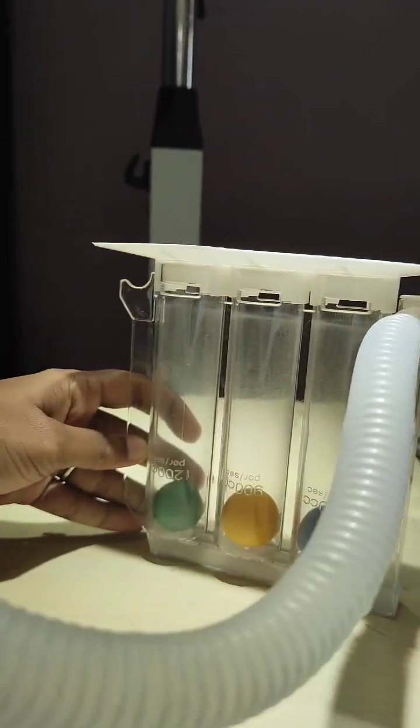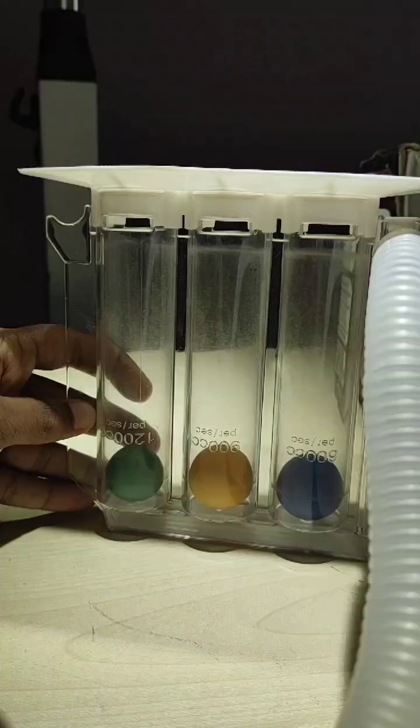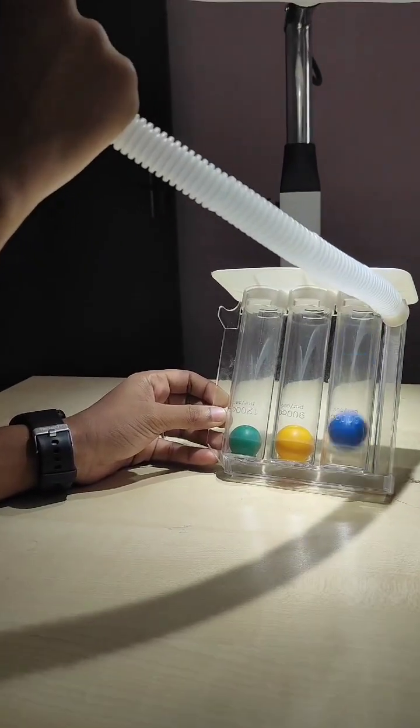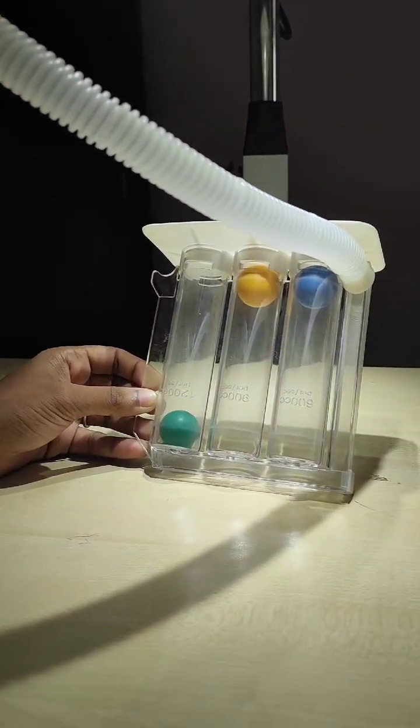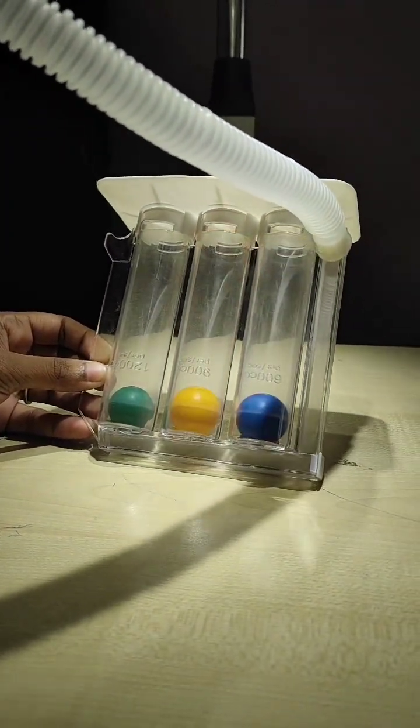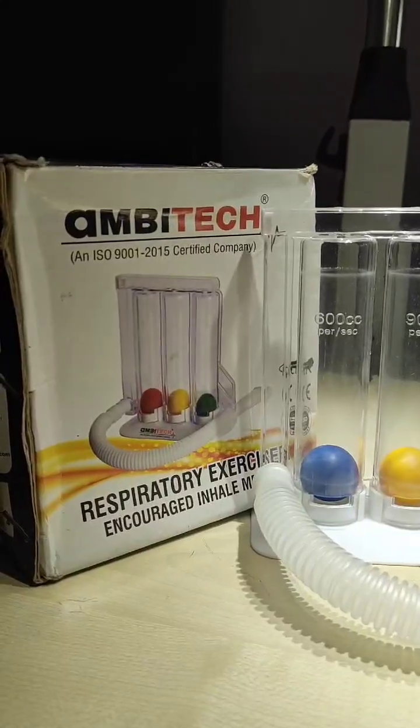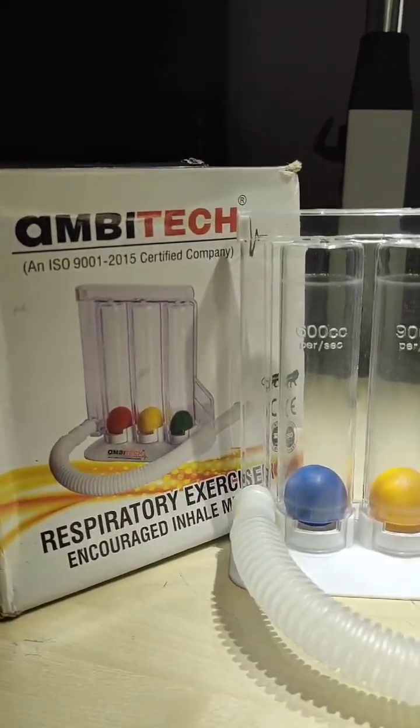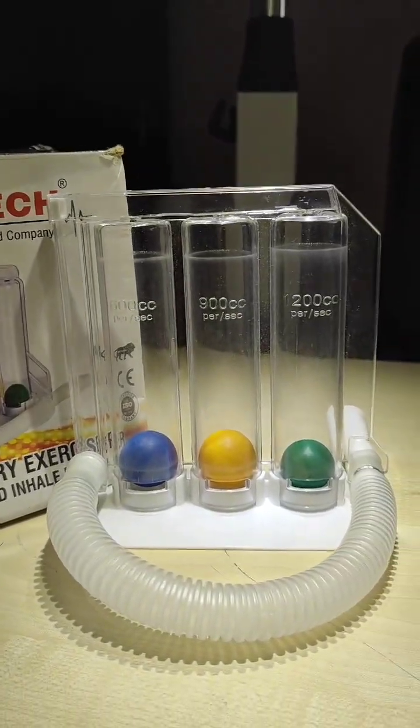For exhalation, turn the device downwards. This position uses gravity to control resistance, making your exhalation muscles work harder and improving your overall respiratory strength. A healthy adult achieves 2500 to 3000 ml.